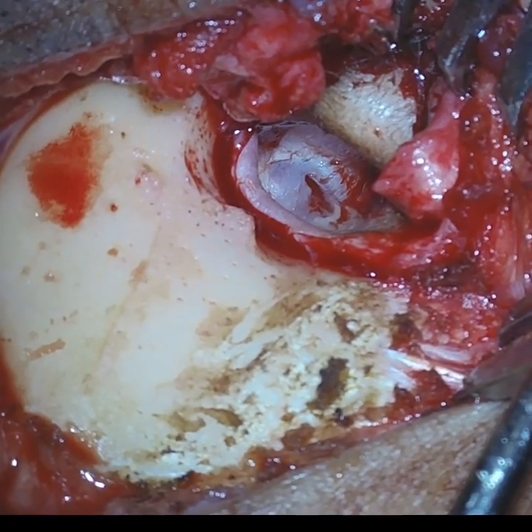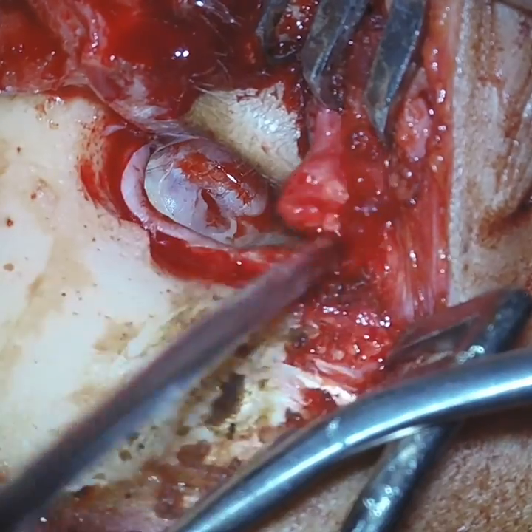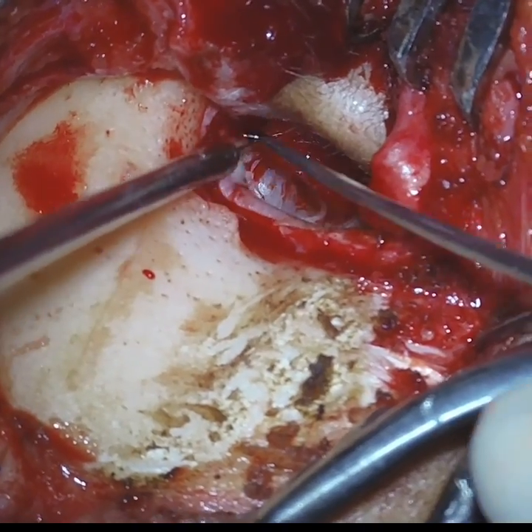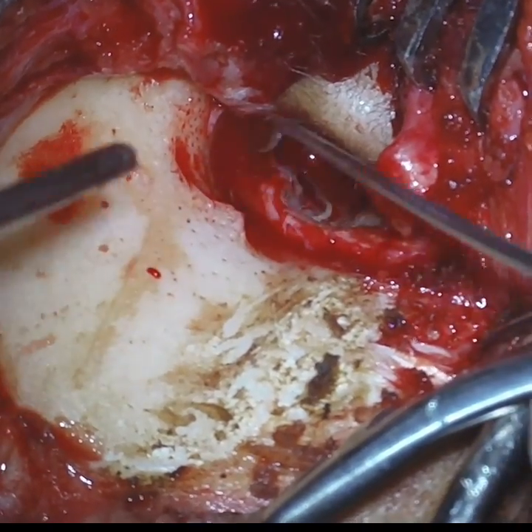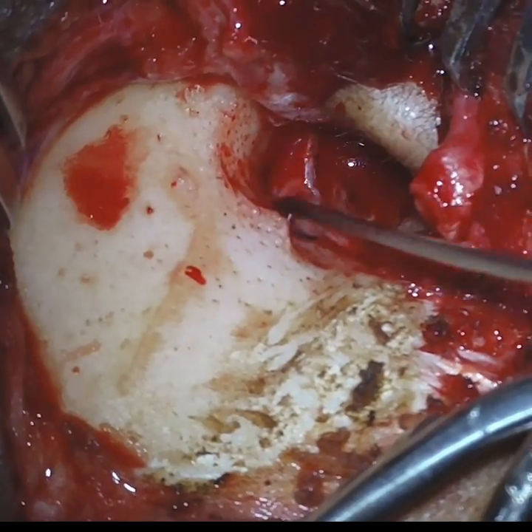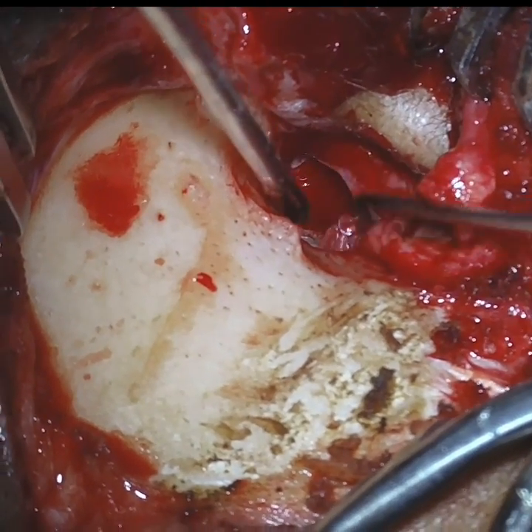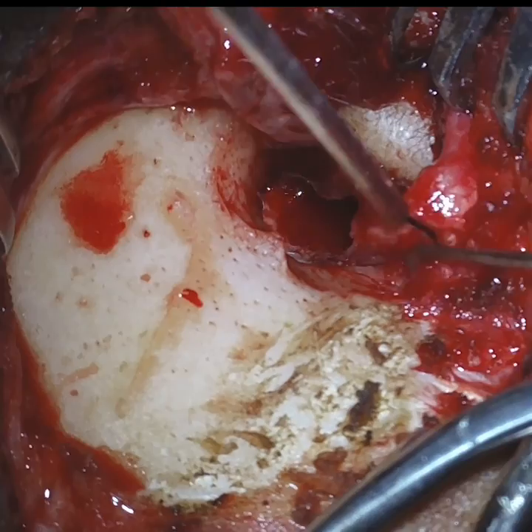Hello dear friends, this is a patient of a labyrinthine fistula because of extensive cholesteatoma. The patient presented to us with hearing loss and acute vertigo. When we examined the ear, we noticed that there is a cholesteatoma destroying the mastoid, and then HRCT temporal bone confirmed there is presence of fistula.